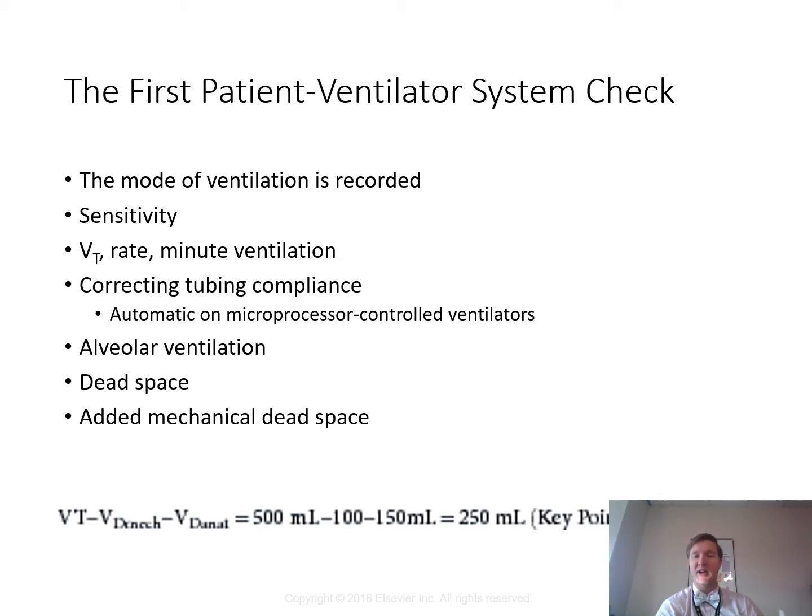I've seen them use the SIMV or IMV in neuro patients that are hyperventilating, and we're trying to use that to reduce their hyperventilation. There are other modes like pressure regulated volume control. Pressure regulated volume control uses pressure to deliver the breath, and it has a targeted tidal volume. So in theory, it's going to use the lowest pressure to deliver that target tidal volume. So it's a combination of volume and pressure parameters to help control the ABG more appropriately while maintaining lower pressures to deliver that breath. There are advantages and disadvantages, and this is not the lecture for that, but understand that with every mode there are different advantages and disadvantages.